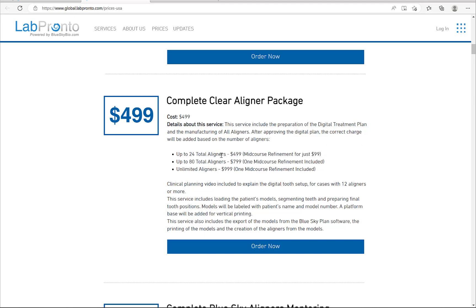The vast majority of cases fall into one of these two categories. If it's a super large case, we have unlimited aligners for $999, which again includes the digital treatment plan as well as manufacturing the aligners. Both of these services are available via LabPronto — click Orthodontics, Aligners from the home page and you'll be able to order these services.